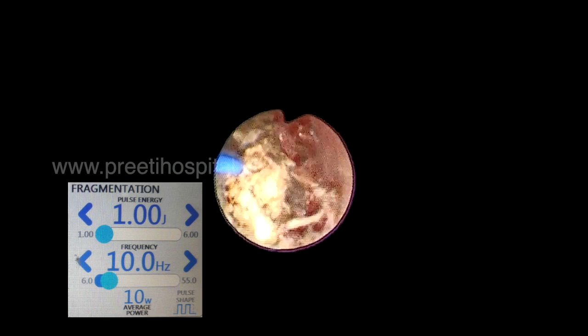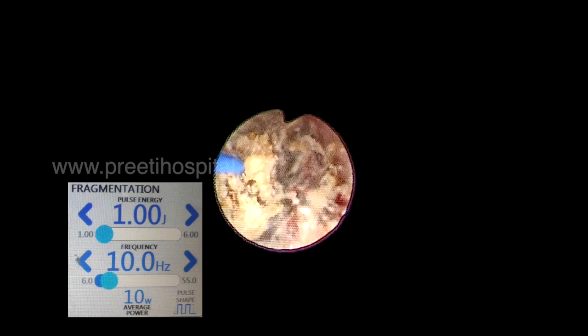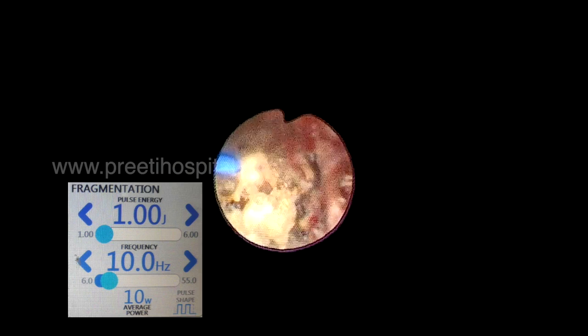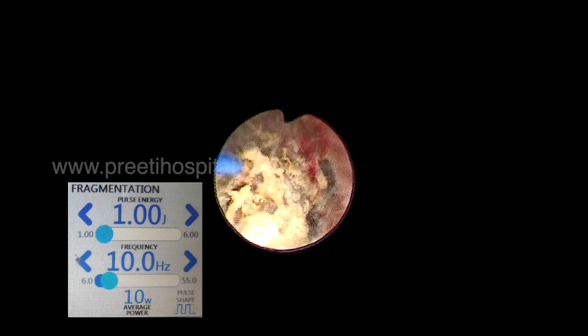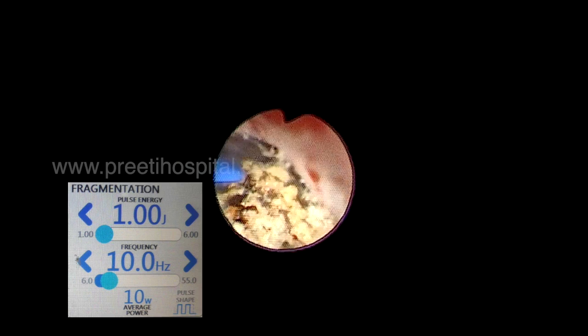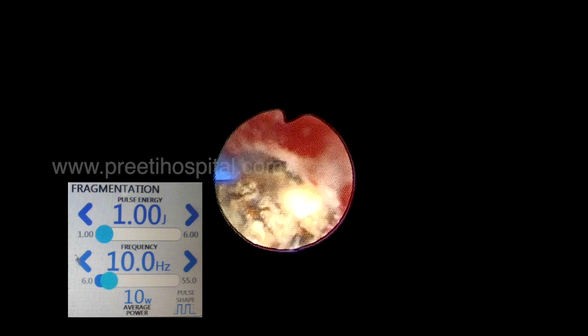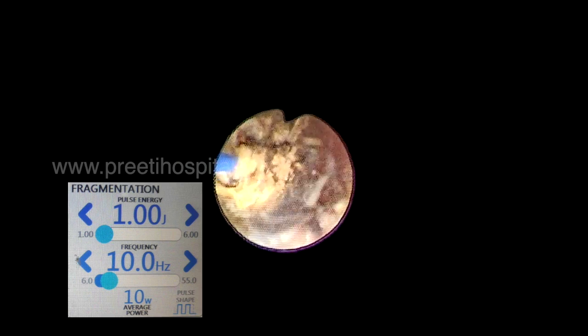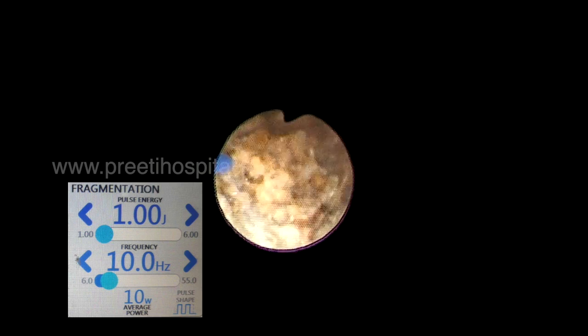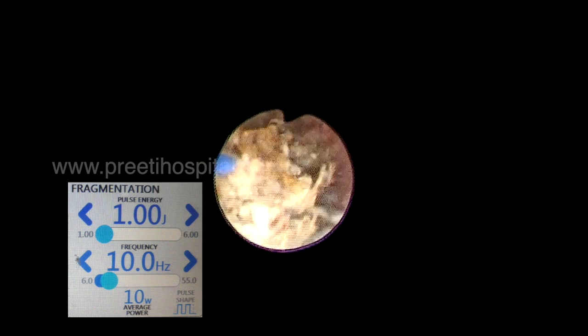That means if this stone has to be dusted at this rate, you have to do either a relook or it will take two hours. So with high wattage — either Thulium or Holmium — what we are doing is we break the stone into two pieces, or maximum three pieces, because in the pelvis you cannot make multiple pieces.